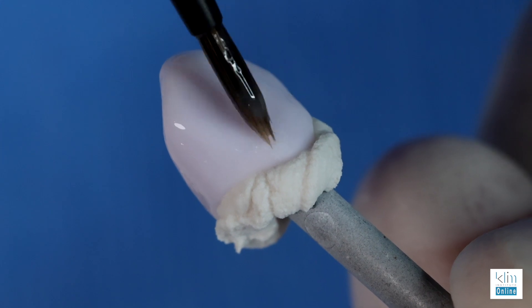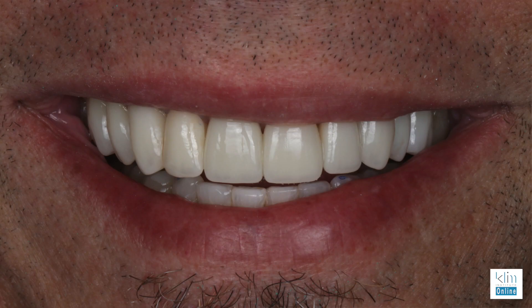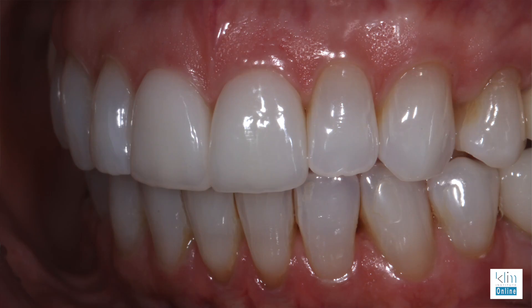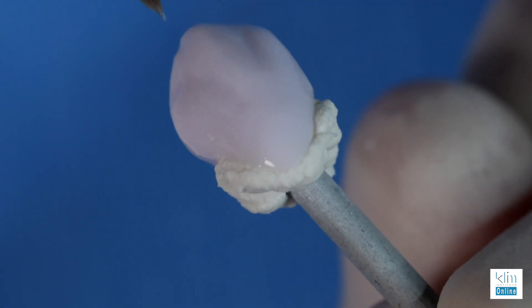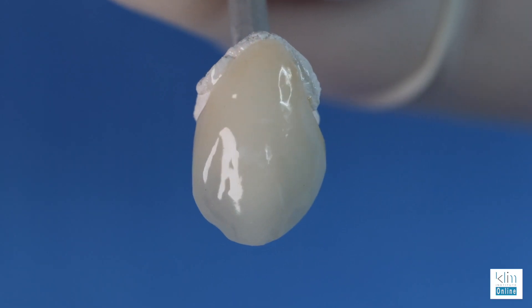This video is about taking a canine, pre-crystallized, adding the glaze and the colors in to create the wow factor. The workflow is so simple and very forgiving. It's easy to use. The colors are translucent, so it's hard to blotch them and it makes them look internalized with the glaze. The thing I like most about 850 is the glaze. One application of glaze and it looks so natural. It looks like that enamel surface you've always dreamed about, that I used to have to polish in with superficial gloss finishing. Now I get it with just a brush on the ceramic surface, pre-crystallized, and when that comes out, there's very minimal finishing I need to do, making my Emax treatment in my clinical theater very efficient.